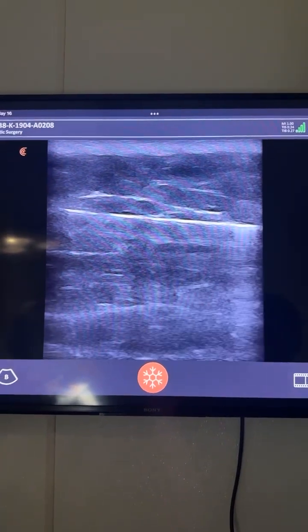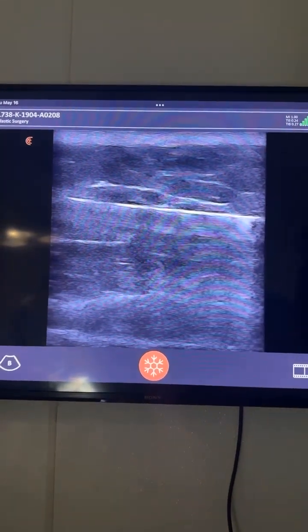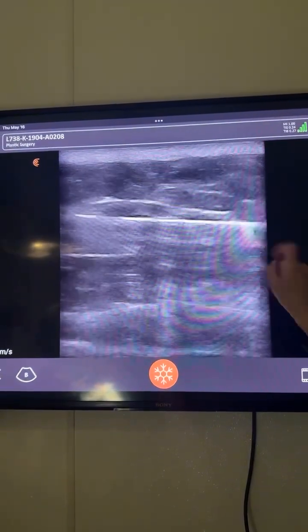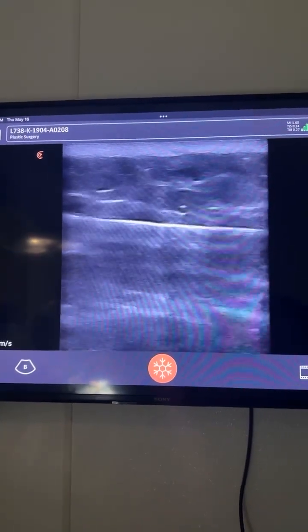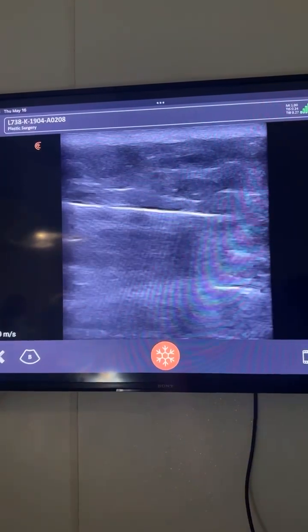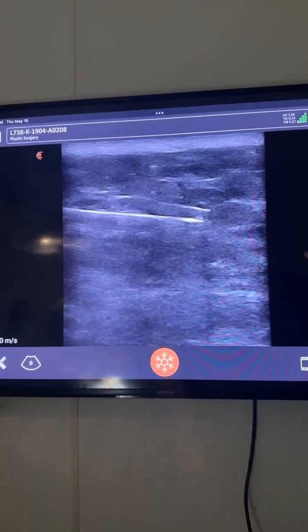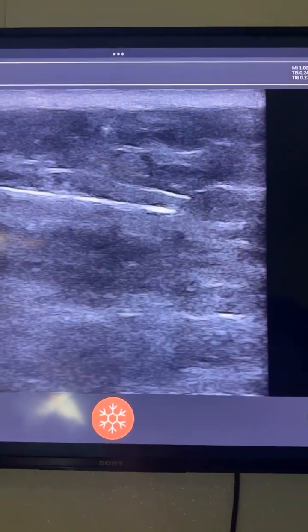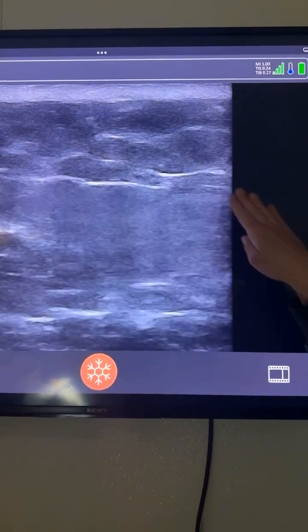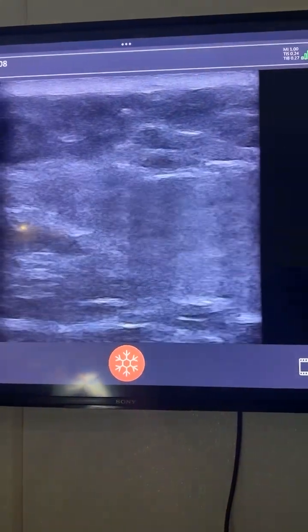All right, so now we are transferring the fat into the butt, and here on the ultrasound, this is the skin. This is the superficial gluteal fascia, and then Dr. Patino's cannula is right here, and he's wiggling it. And then below is the deep gluteal fascia here, and then the striated muscles. So he's very far away when he puts the fat into the butt. Okay, now look at the tip of the cannula right there. Right here. And now I'm going to give it a bolus. So it's a cloudy gray area here, and it's pushing the muscle and the deep gluteal fascia down as he puts the fat into the area.